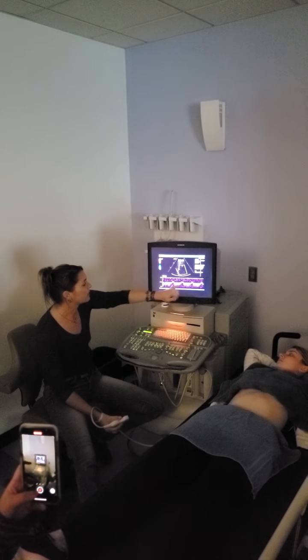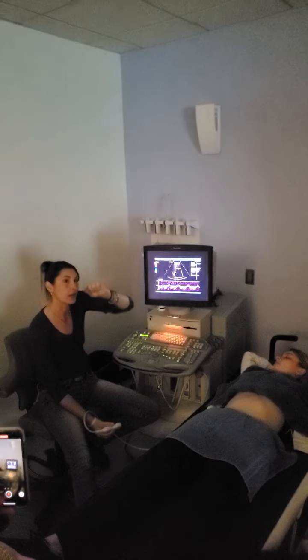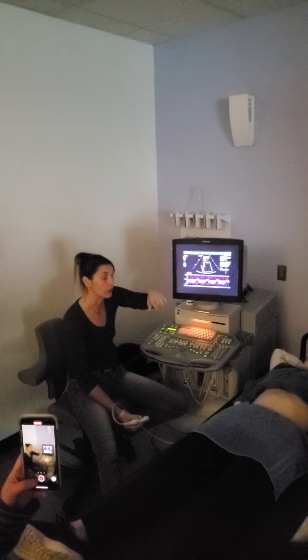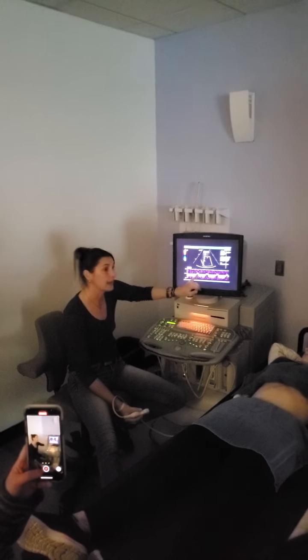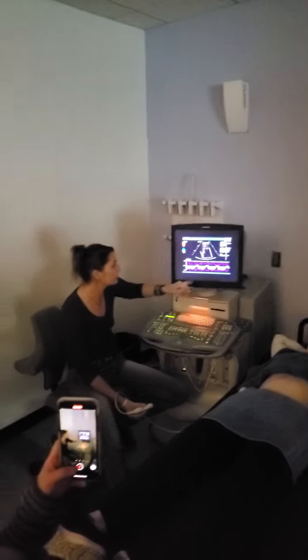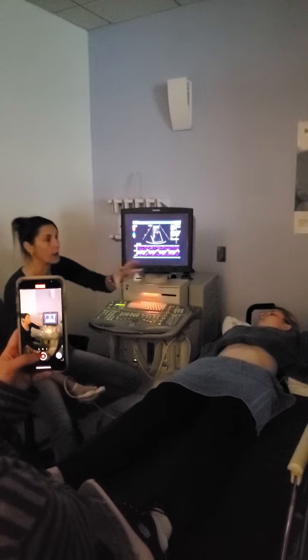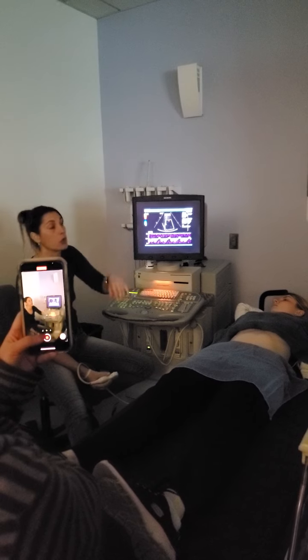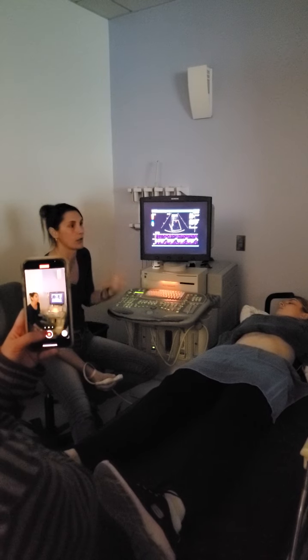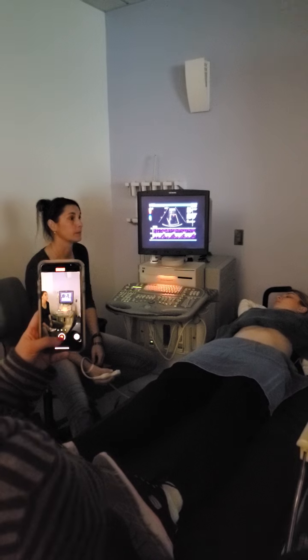The other reason that this takes on this, it looks almost like arterial flow. So when we look at arteries, we're going to have a big increase with systole, and then as diastole hits, it's going to kind of peter out or even go backwards. So this looks like pulsatile flow, but we only see pulsatile flow in the arterial system, but the proximity of the right atrium encourages this kind of waveform to occur, the Wonder Woman sign. So it looks like a pulsatile vessel, but it's just because of the proximity to the right atrium, kind of tricking us, because it's truly a vein.